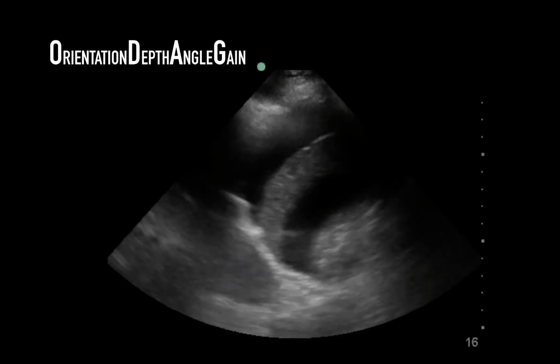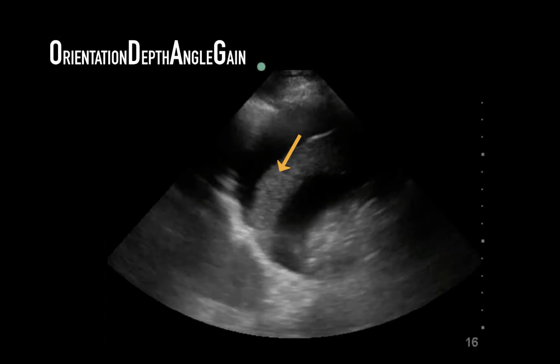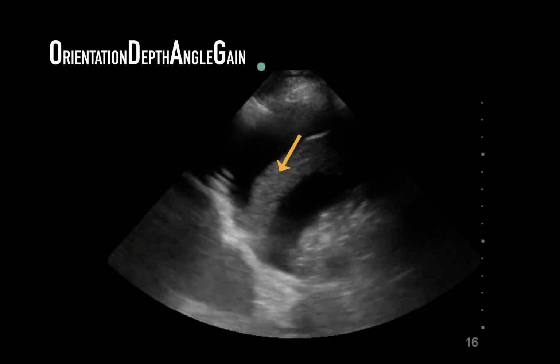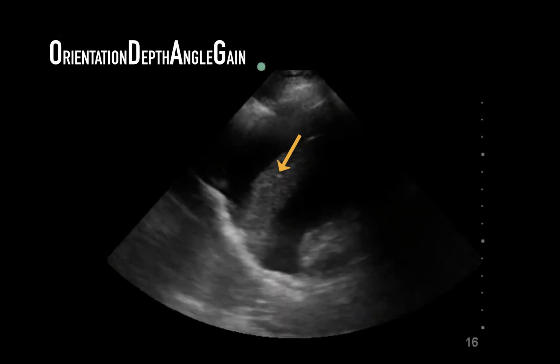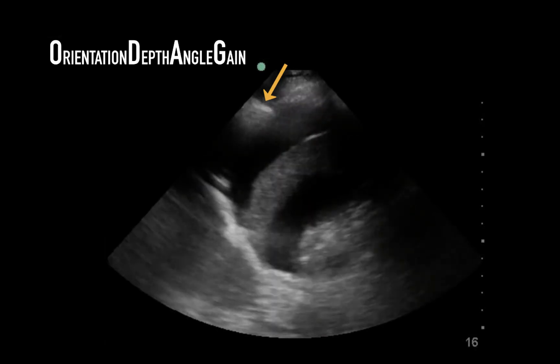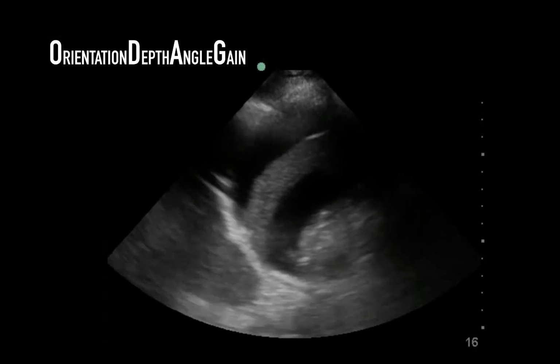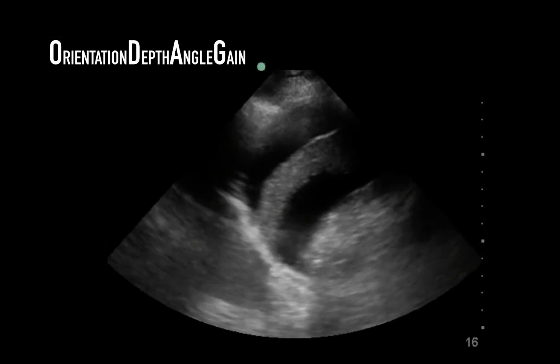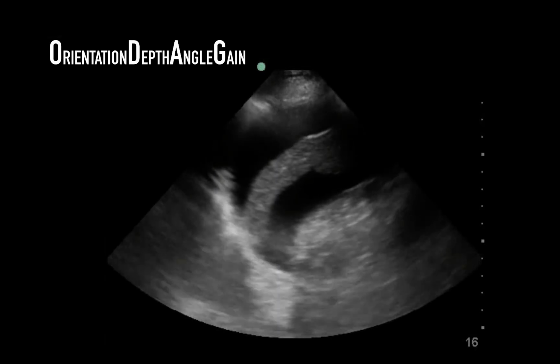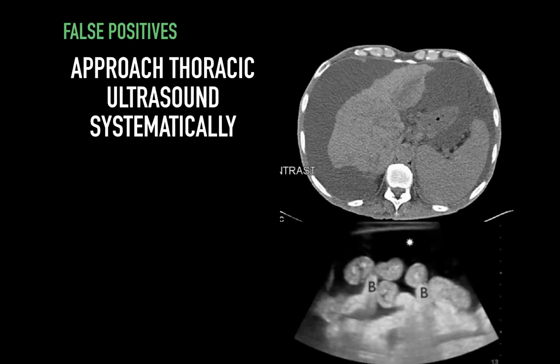Here we can see that there's the diaphragm moving, which is actually delineated by this structure. Below that, this appearance may be easily mistaken for the lung. In fact, this is an atrophied spleen that's really kind of marinating in an anechoic space of intra-abdominal free fluid. On the screen left here, we see actually lung sliding, which you may not have recognized at first. But the actual pleural space is above this line. And there is much more fluid below the diaphragm than there is above the diaphragm. This really emphasizes why you should be clear on your landmarks and why you should approach ultrasound systematically.